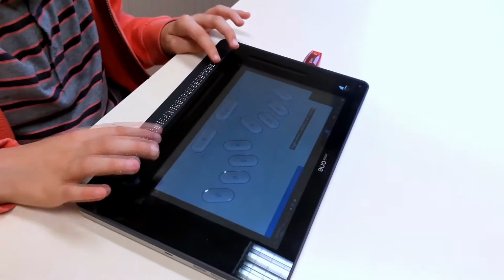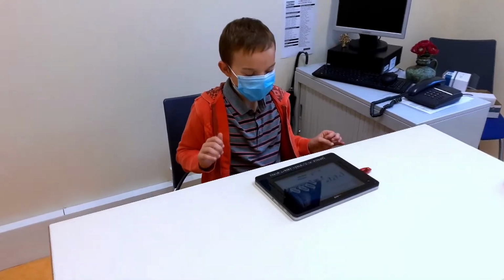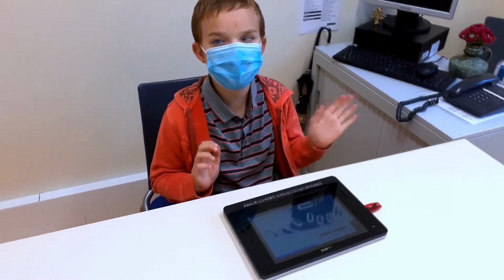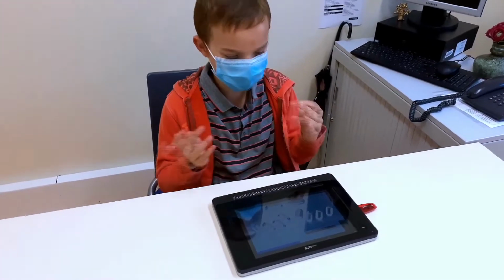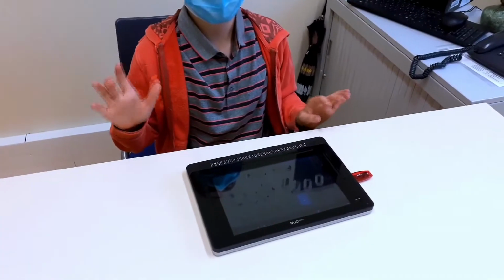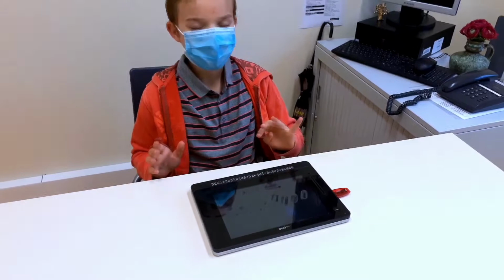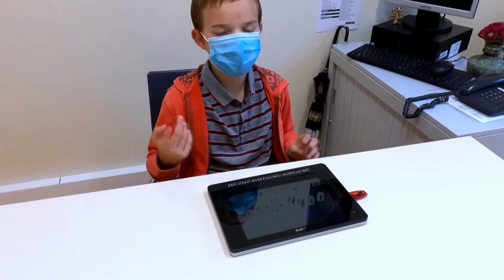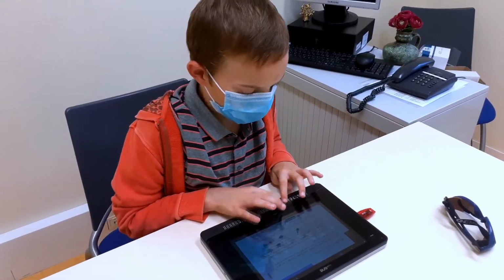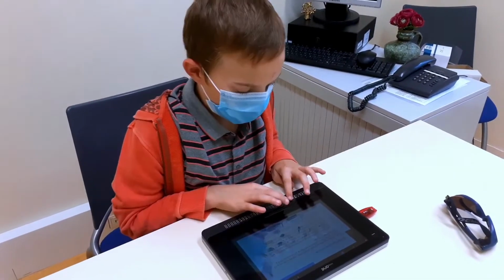I then click on insideONE. Then I see Home in the hard drive, and I see D. Léoric David. Then I click on it, and click on it twice again in the right slider with 1 finger to select the name of the file and give another name. Video test, for example. When you are done, I swipe 2 fingers to the right on the bottom slider. Here you have cancel or OK. Once I click on OK, it says running operation. Then a small sentence is displayed: your file has been correctly exported. Then I click OK, and it's saved on the USB stick.